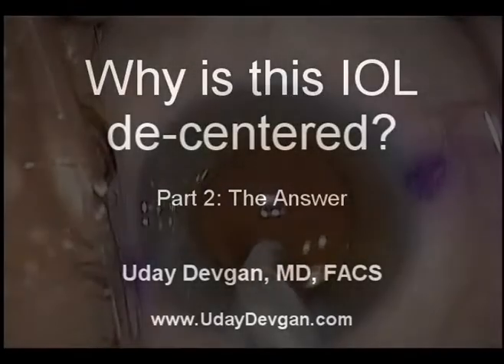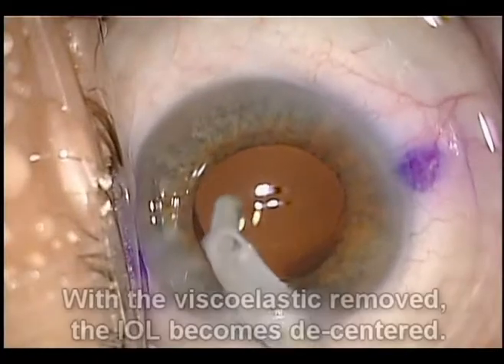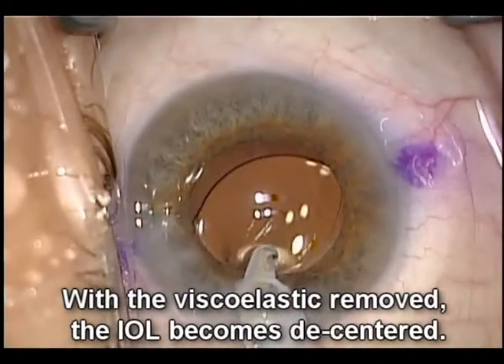The answer to why is this IOL de-centered? Removing viscoelastic caused this IOL to become shifted out of the visual axis.